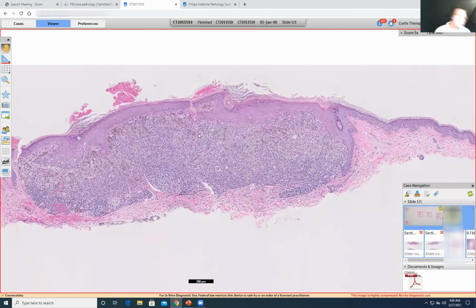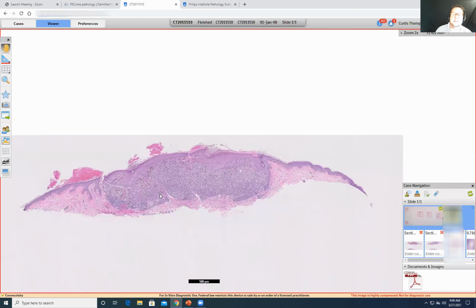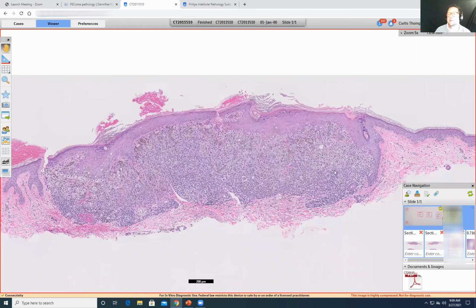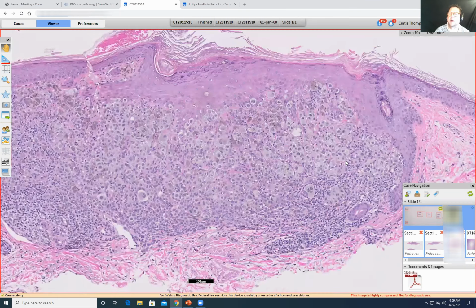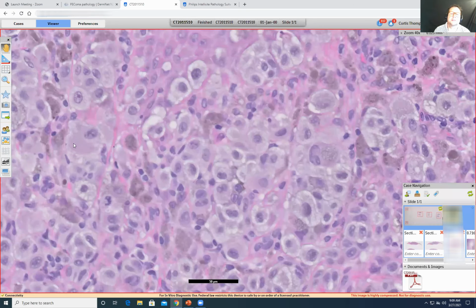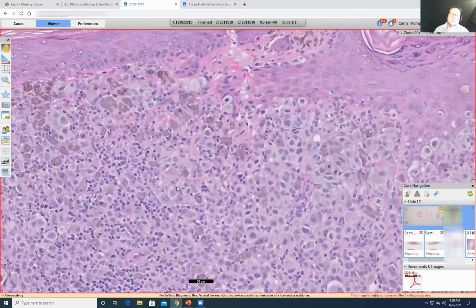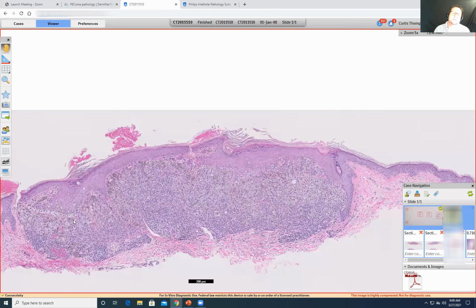Here we have another melanocytic lesion, and this is once again a 61-year-old with an irregular brown patch on the shoulder. So we're on sun-damaged skin here. And you can see here a proliferation of highly atypical cells, even at this power. Lots of melanophages, so it's pigmented. And then you can see this foamy cytoplasm, similar to what we were looking at in the other. And this is just a good demonstration of having those same clear cells.